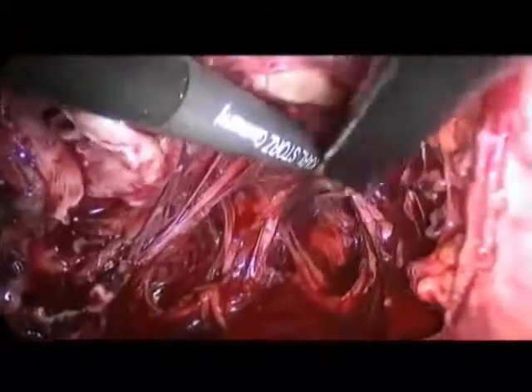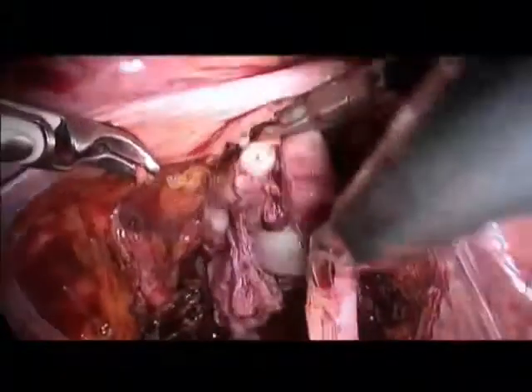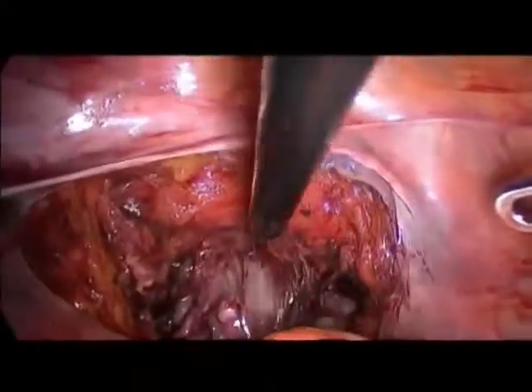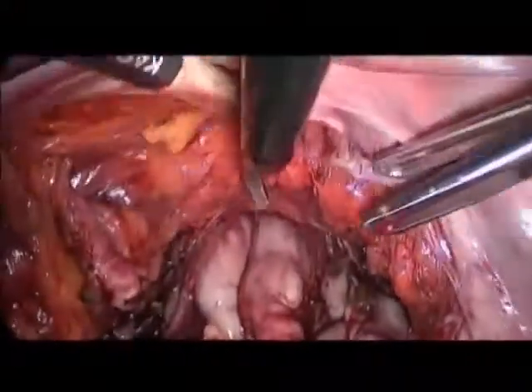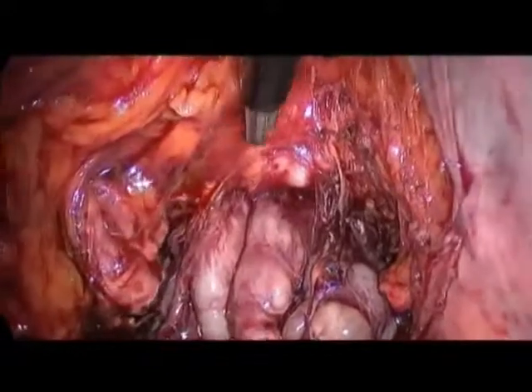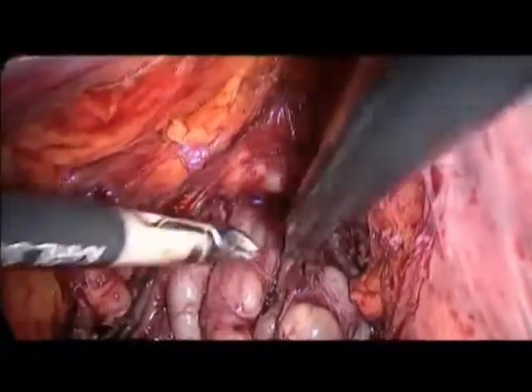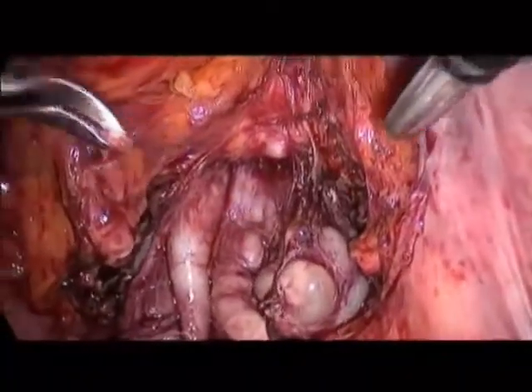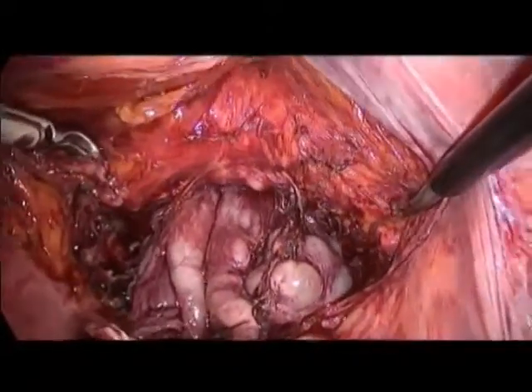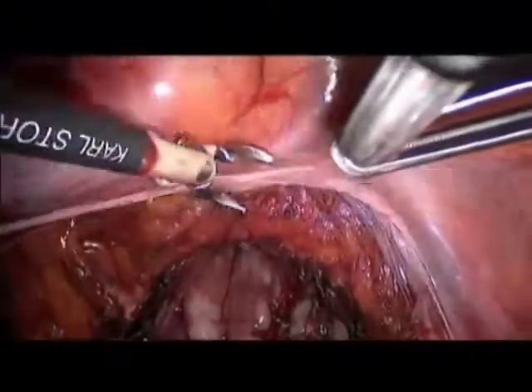So we will now leave the posterior aspect like it is. You can drop the seminals and leave them there. You see that later on we will come through this thick layer here, which is the anterior aspect of the Denonvillier or the vesicoprostatic muscle as it is actually called, and we will immediately find this prepared plane, which is another advantage of this approach in terms of anatomic landmark. So we will drop the incision now and move to the development of the anterior aspect.